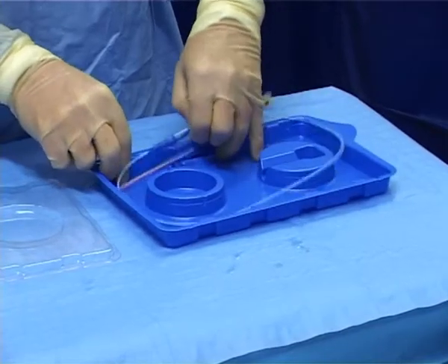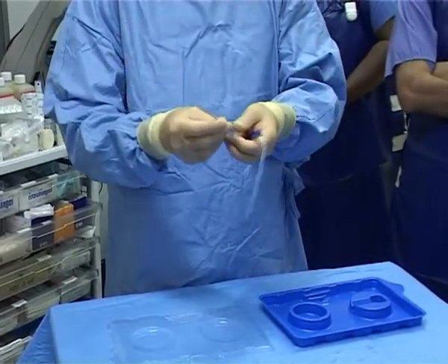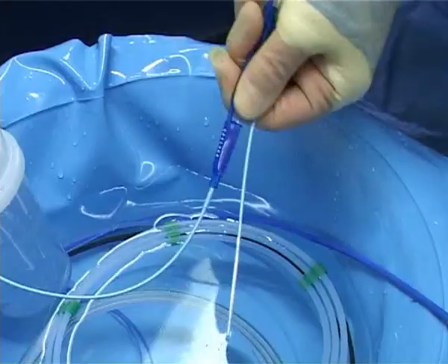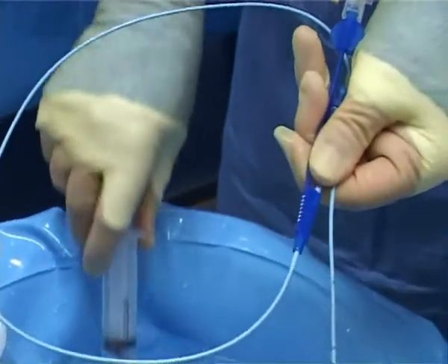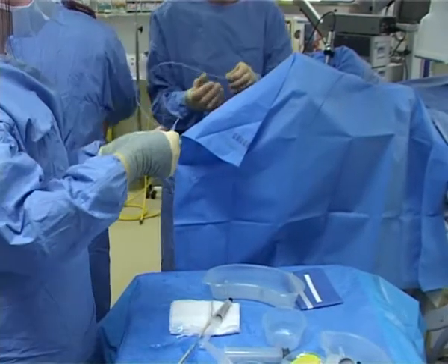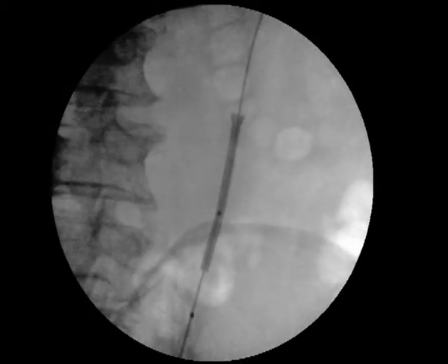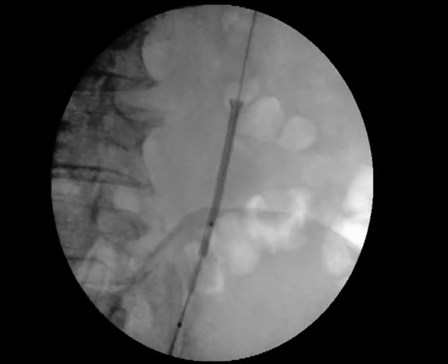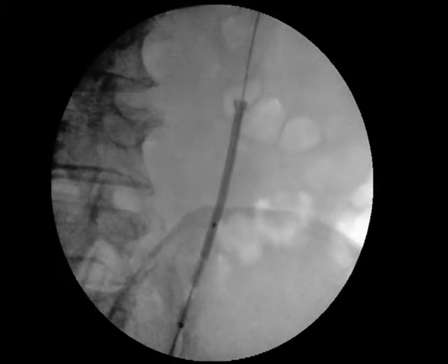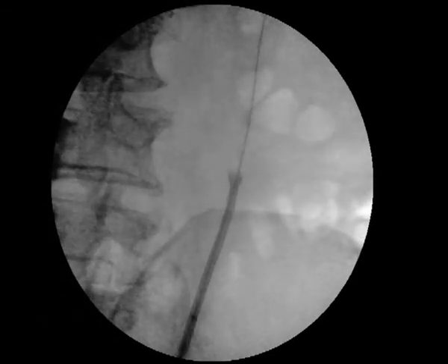We use a standard Uromax ureteric balloon catheter as our repositioning tool. Always ensure that the equipment is flushed and wet. The balloon is gently advanced halfway into the stent and is manually, gently inflated with contrast until it grips the stent. The stent can then be moved into position.